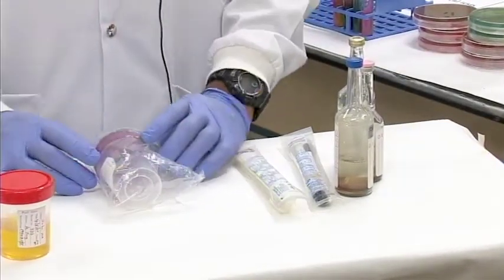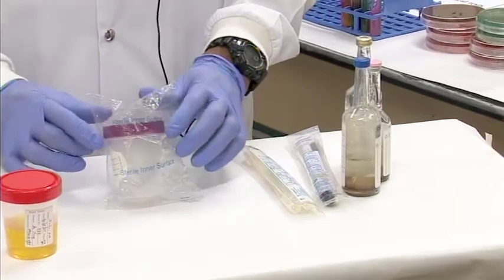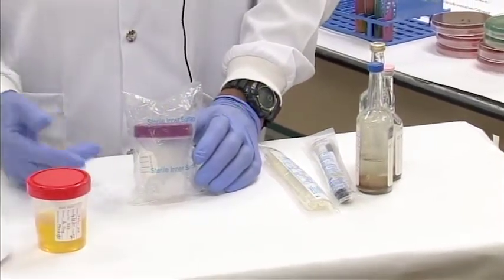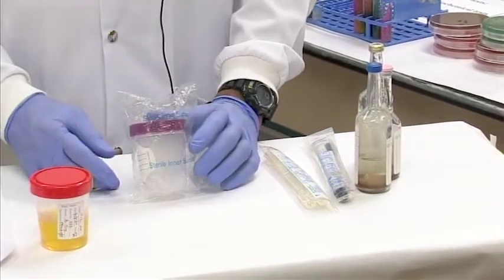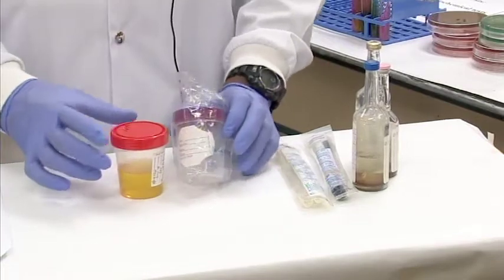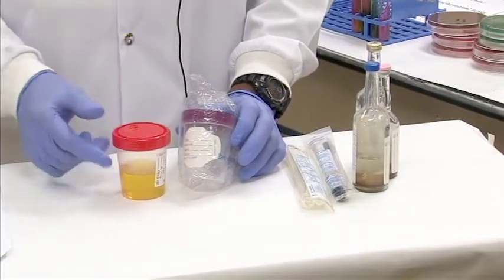You will also have sterile specimen containers that are used to collect a number of other samples, for example, urine, as we said, maybe a stool sample, maybe a sputum, etc. Please note that the sample must be labeled properly after collection as to the nature of the specimen, the date, etc.